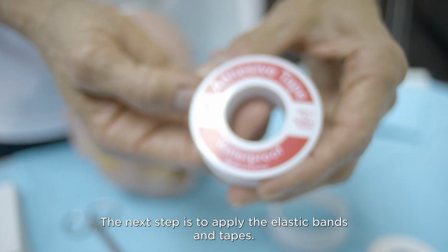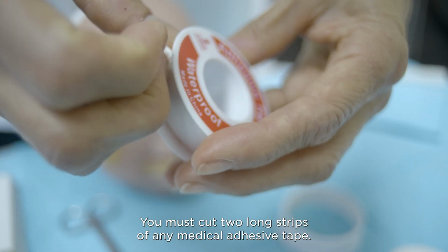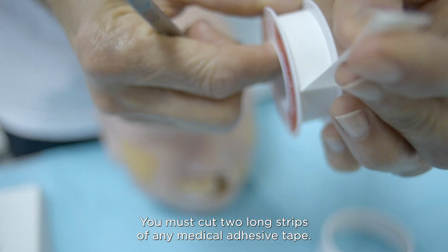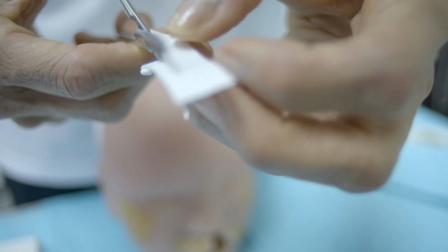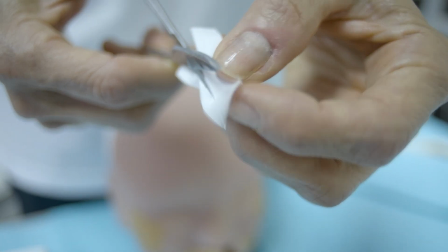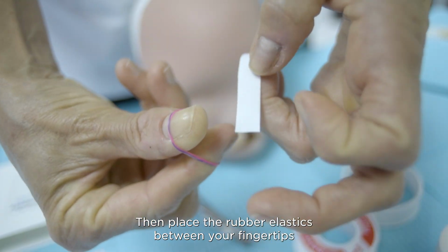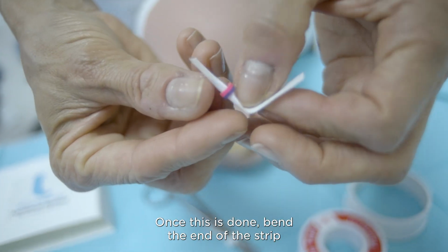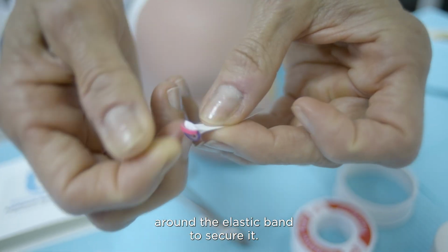The next step is to apply the elastic bands and tapes. You must cut 2 long strips of any medical adhesive tape. Then place the rubber elastics between your fingertips so that you can insert the end of one of the strips. Once this is done, bend the end of the strip around the elastic band to secure it.